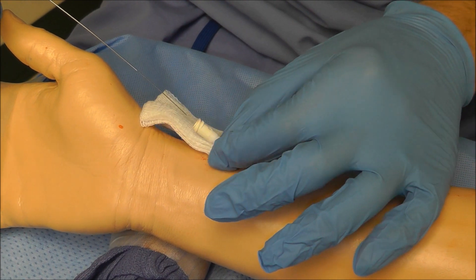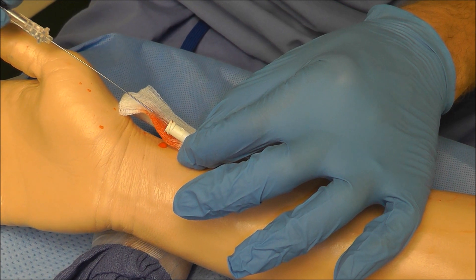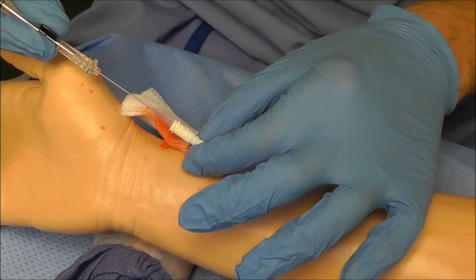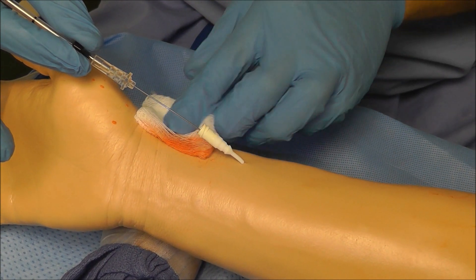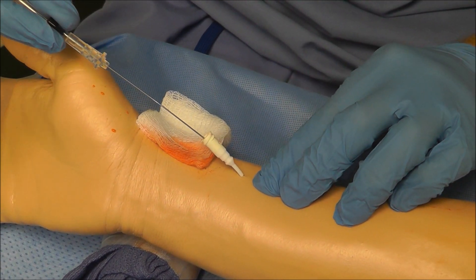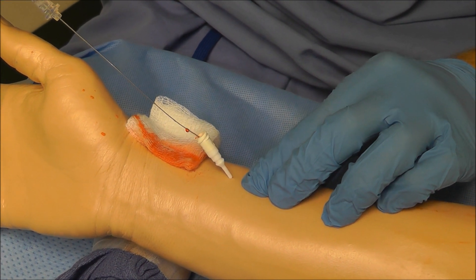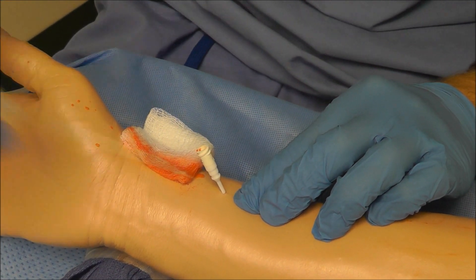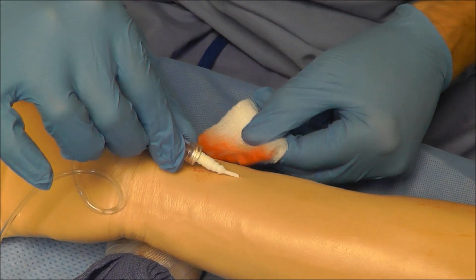I'm going to pull this back until I see blood coming back. There we go — now I can advance this wire in. Now I advance my catheter over the wire. I'm going to hold pressure here, but let up just briefly to make sure that I'm in. I'm in. So I hold pressure there, take my needle out, and now I can hook up — and we've saved it, and we're done.